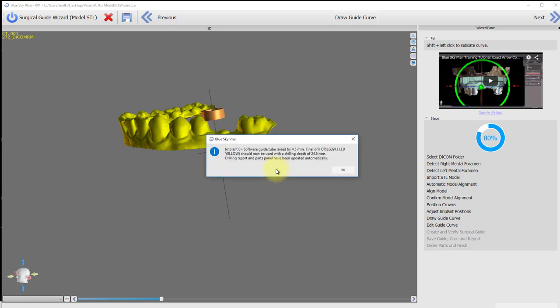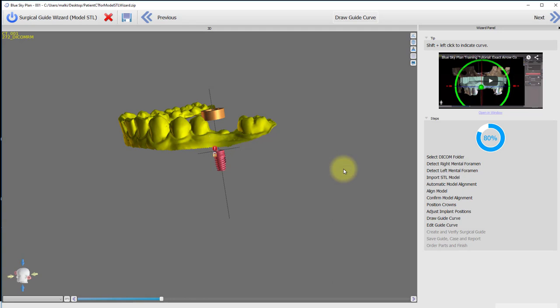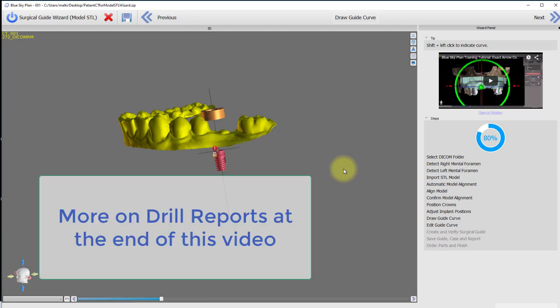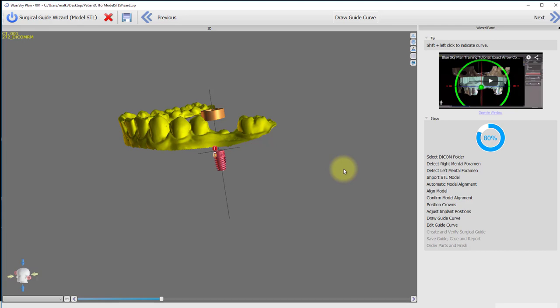The program responds with a window letting you know how the collision was resolved and that the drill report will contain the new drilling parameters. Click OK to continue with the remaining wizard steps in order to complete the case. For your convenience, we will show how to obtain a drill report at the end of this video.